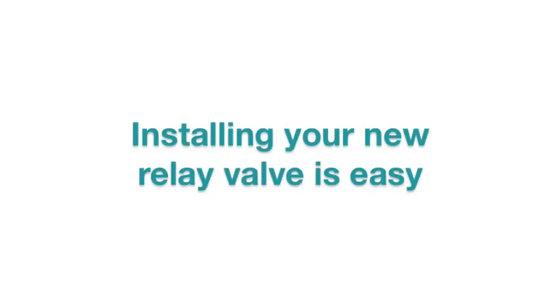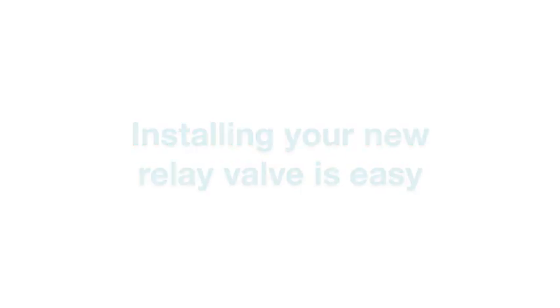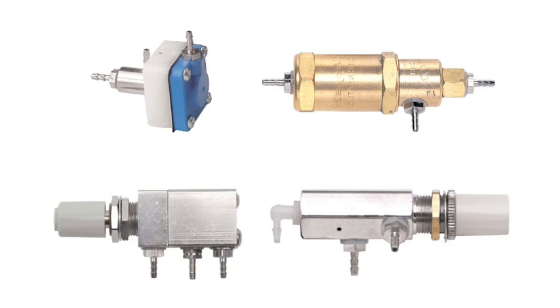Water relay valves come in many styles and shapes. Some even have a needle valve or flow control incorporated into them, but they all do the same thing, and installing a replacement could not be easier.